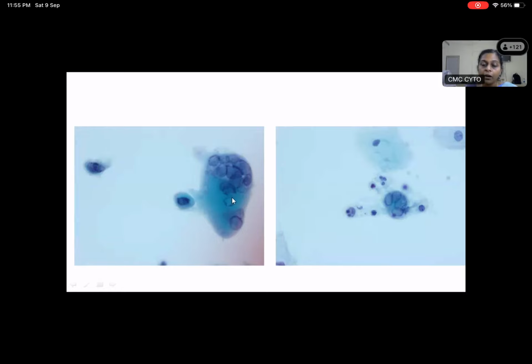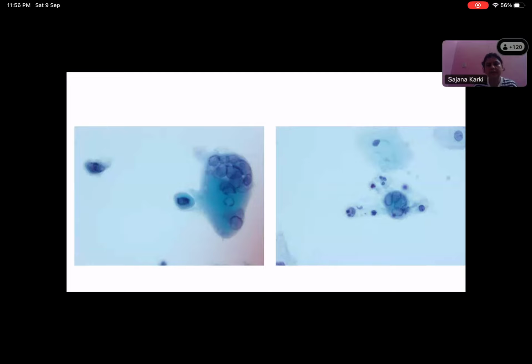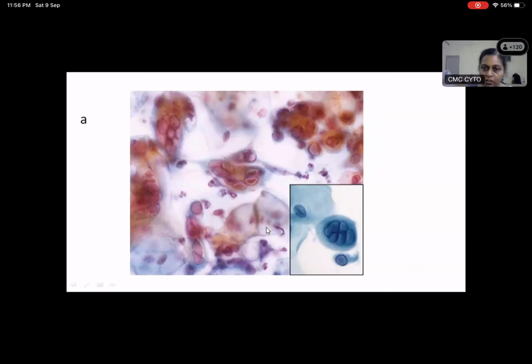So how do you identify that it is herpes simplex virus? There are 3 M's that are seen in HSV. What are the 3 M's? Multinucleation, molding, and margination. Excellent. What is the margination due to? What is getting marginated? Due to the nuclear inclusion, the chromatin is marginated, because the virus is filling up that space.